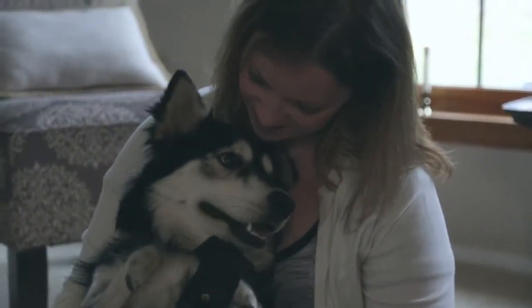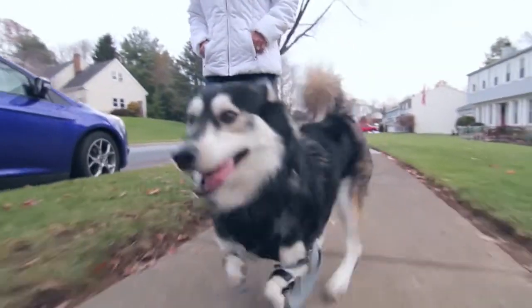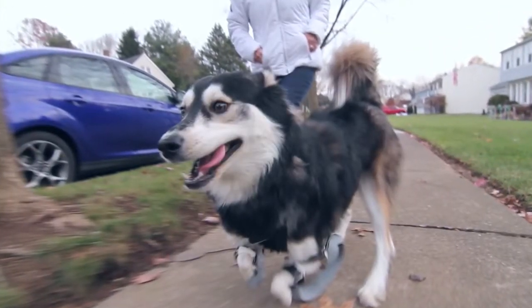This is what 3D printing is all about — to be able to help anybody, dog, person, whoever, whatever, to have a better life. There's no better thing to be involved in.